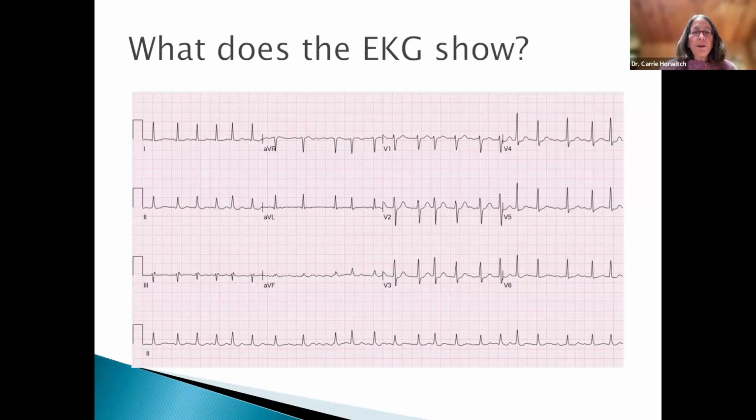For the sake of time, I'll just say it's fast. Tachy, thank you. It is not sinus, right? I'm not really seeing much in the way of P's, or there's maybe some P's, but there really aren't P's followed by QRSs.